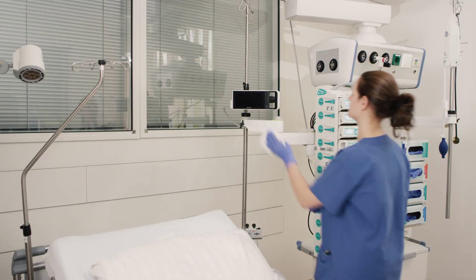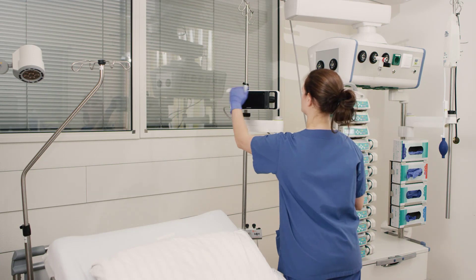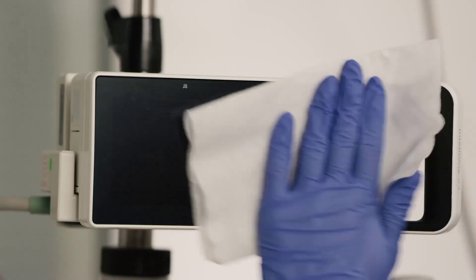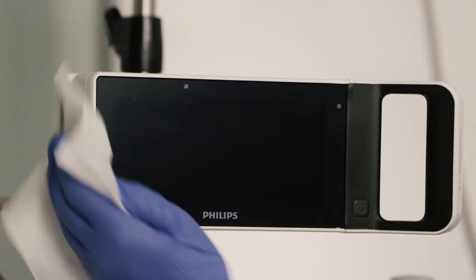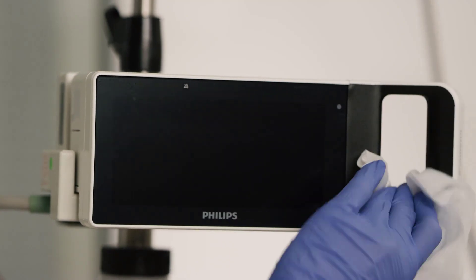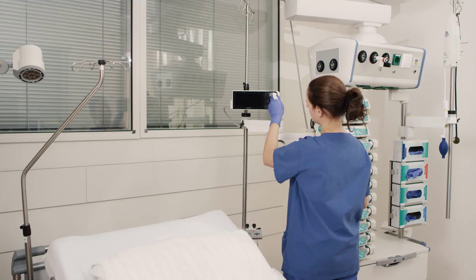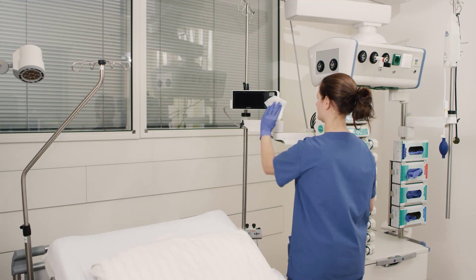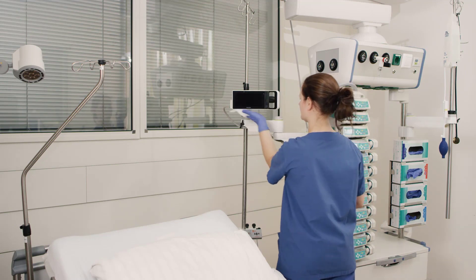If equipment needs to be shared amongst patients, clean and disinfect your monitor, modules, multi-measurement module, measurement extensions, module rack, remote control, cables and accessories between each patient use. After cleaning and disinfection, check the equipment carefully. Do not use it if you see signs of deterioration or damage.